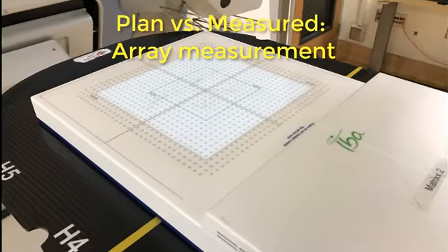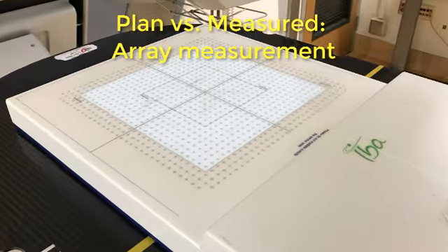So you could have an array. Here you're doing planned versus measured on this array of many different points in the phantom, and so on. So there are many different ways to accomplish these tests. You could use film as well. So let's go through these MPPG recommendations.